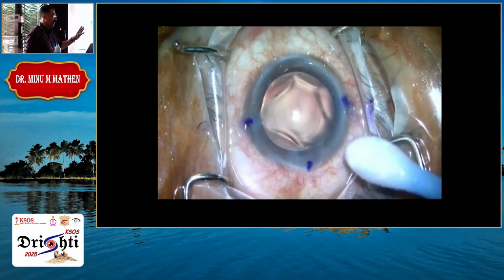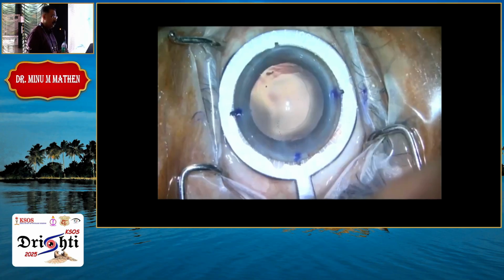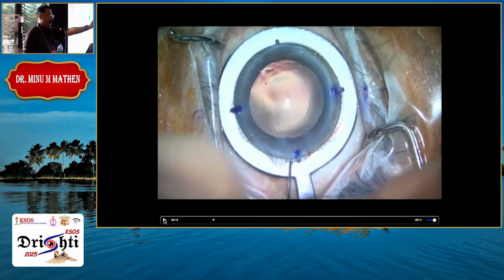Madam touched all these things, but it was too fast. I am going it very, very slow. And then have this one. I have 2 printouts. One is in the case sheet and one is stuck onto the microscope. So you will never go wrong, because flipping or changing the other eye are very common.